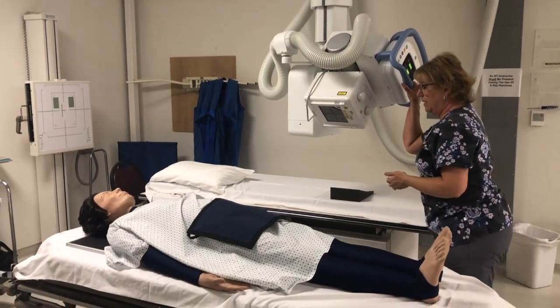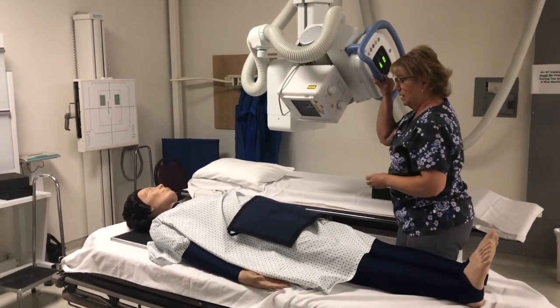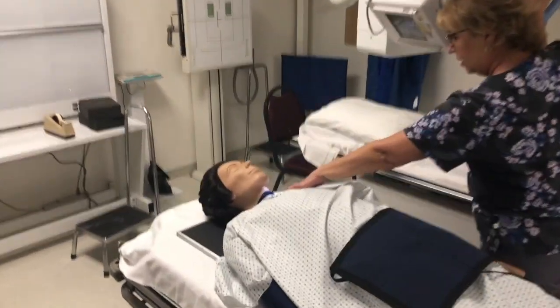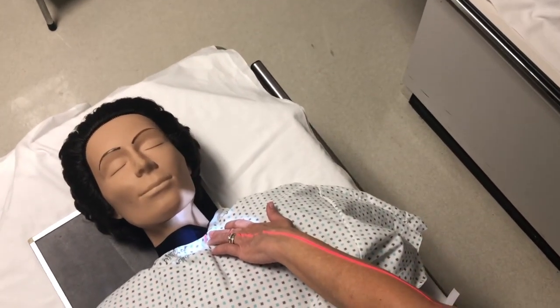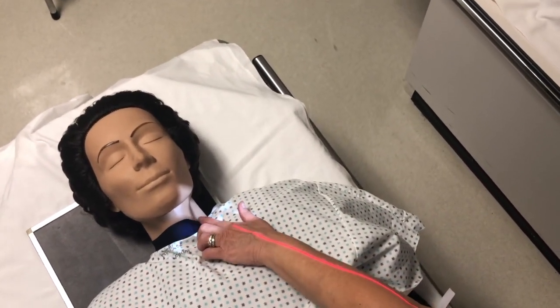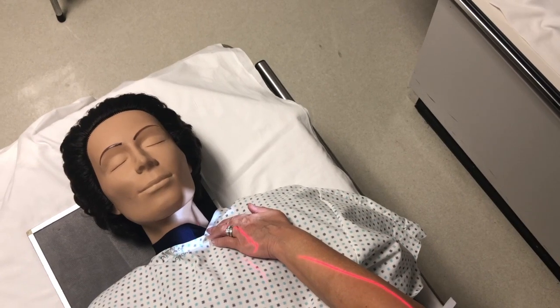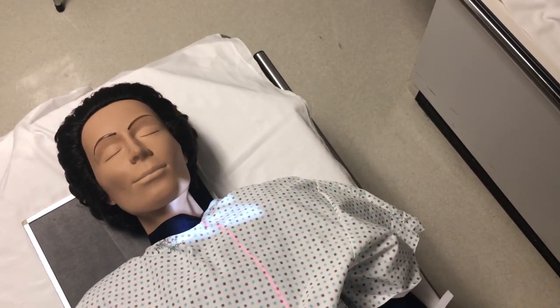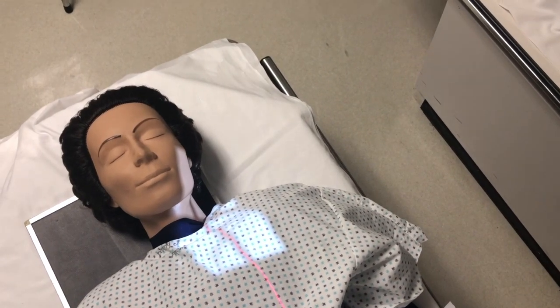But once you have that double tube angulation in, then you can center at the level of C4. And so here's C4, and then I'm centering right in the middle of the neck. I'm gonna open up my collimation.